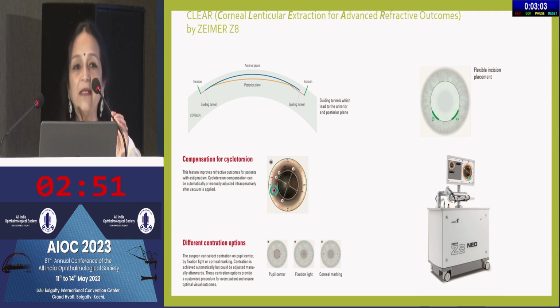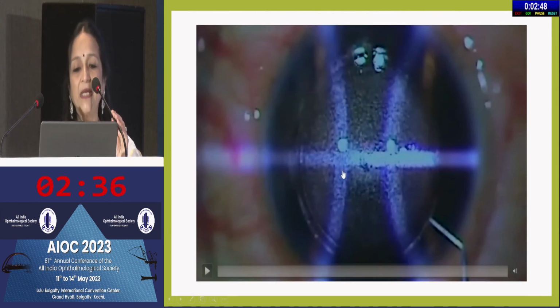There are, like other new platforms, compensation for cyclotorsion and different centration options, and it now has worldwide experience with multiple users and is showing pretty good results. This is how it works.